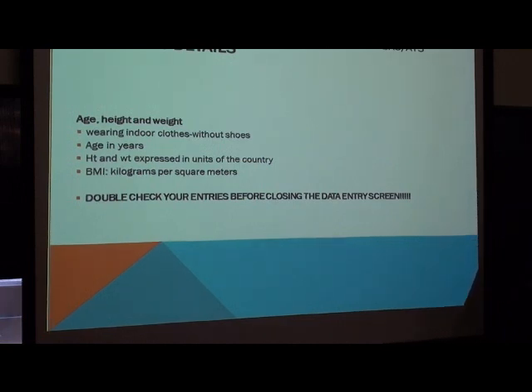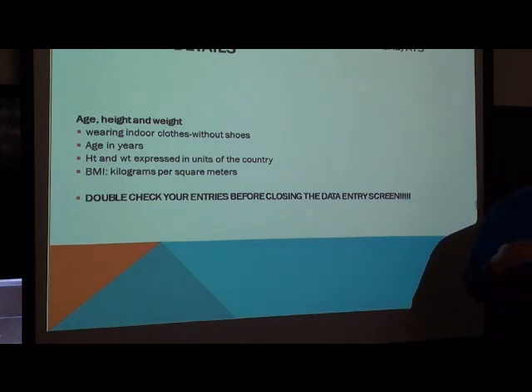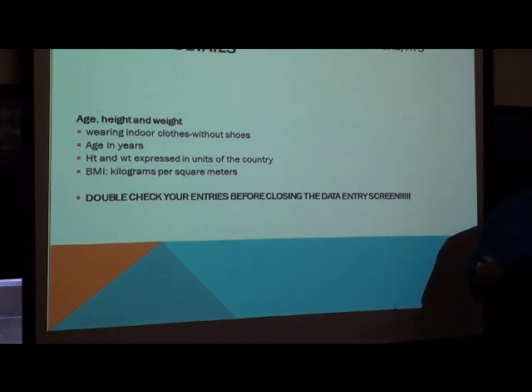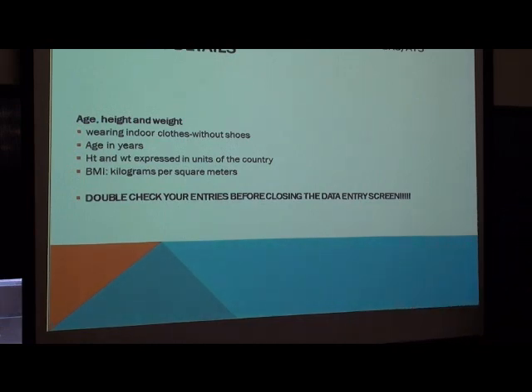So these can be incorrect because they were either asked to the patient, what is your height? They could be incorrect because they were misentered, fat finger syndrome. Or you could be taking it as truth from the previous visit. And so we see a lot of errors perpetuated from one visit to the next. And so you need to take the opportunity, and nobody's going to fault you for taking a little extra time to just, before you save the data that you've entered and imported into the data entry screen, double check your entries before you close it, before you save that data.